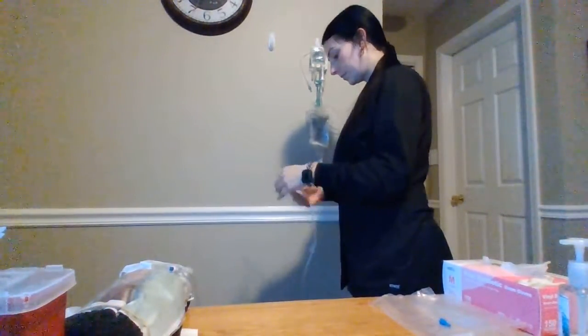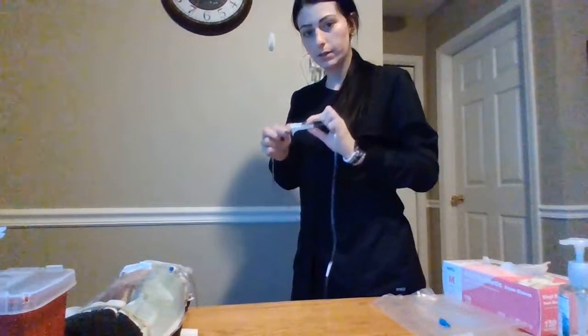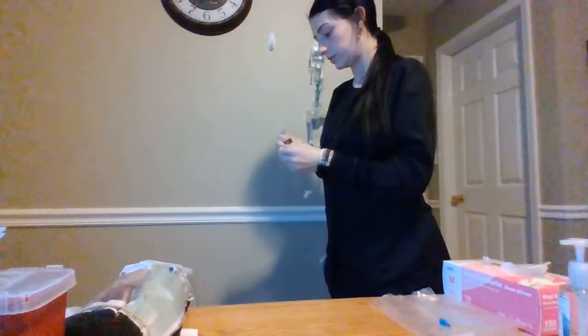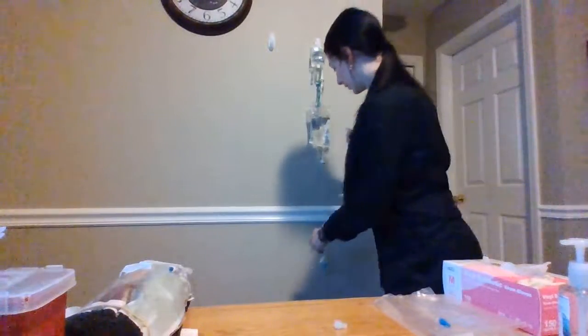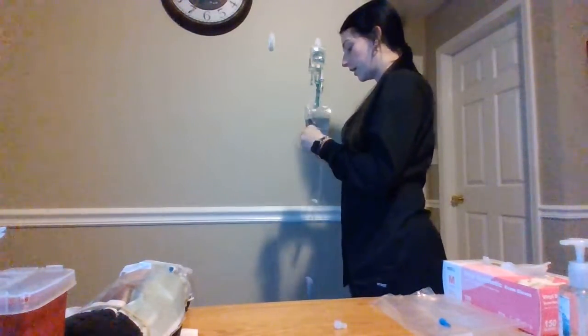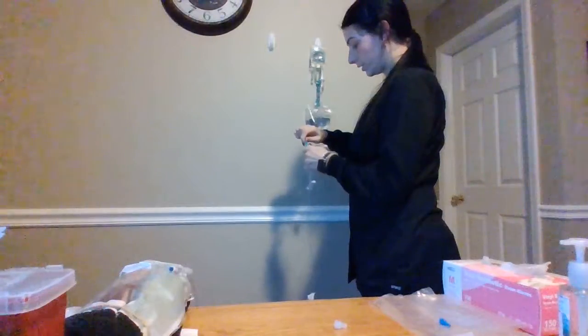Hand hygiene. All right, I want to now ensure that the clamp of the primary line is closed. Primary line clamp closed. It's not going anywhere. We are going to take the secondary line and an alcohol pad. And get the alcohol pad out. All right, I'm going to remove the cap off the end of here. And I am going to scrub the primary line port vigorously, making sure I'm not touching either. I'm going to attach the secondary line to the primary port, as so.